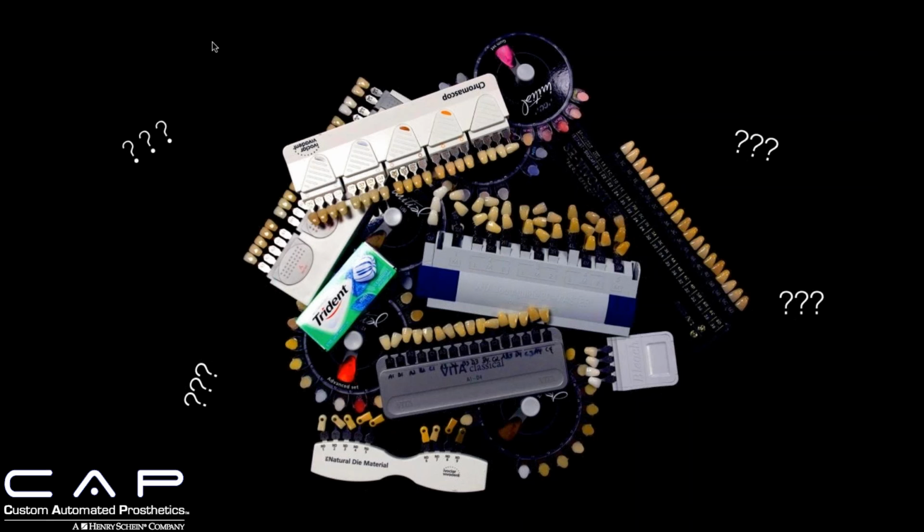And I'll use anything chairside, whether it be the stump shades or the initial shade guides, porcelain tabs, too. If someone has a very strong blue or gray incisal edge, I'll match that effect tab or the shade tab that matches that effect.